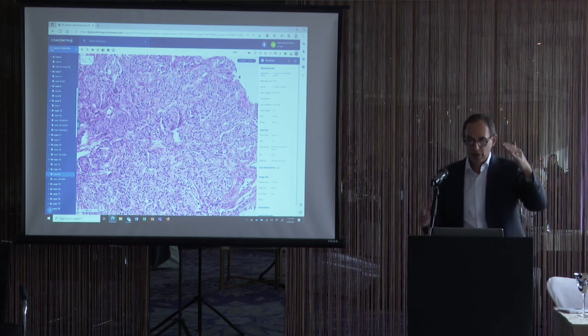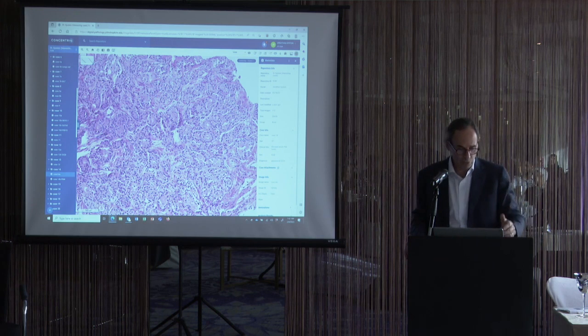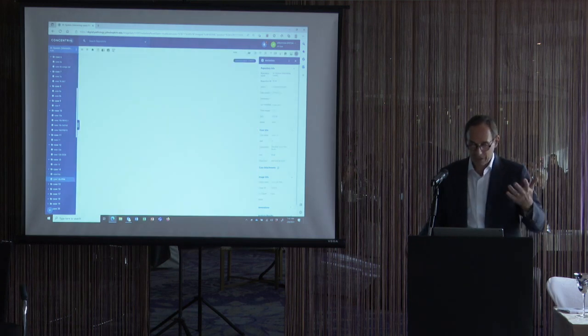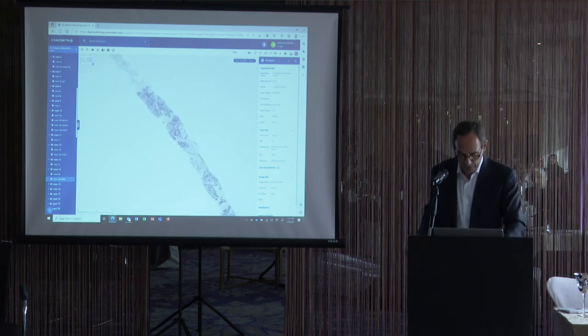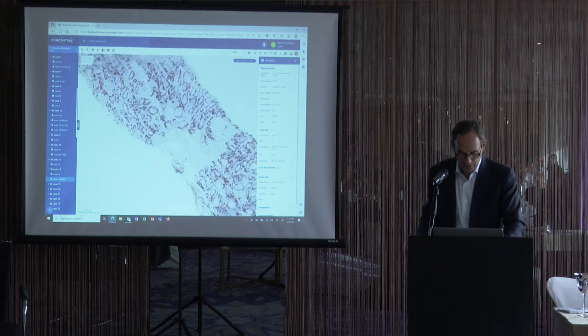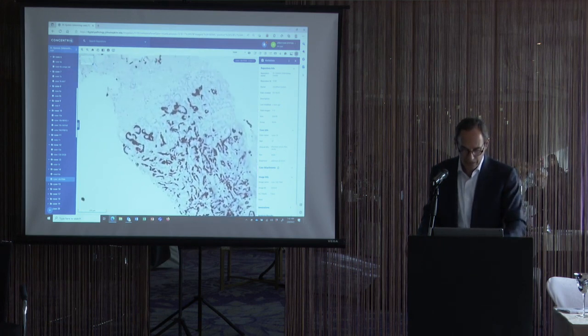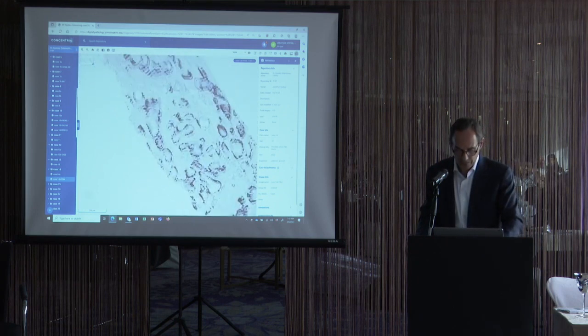You have to say, okay, these are all the features that Dr. Epstein talked about favor cancer. And there's just not many features favoring cancer in this biopsy, despite it architecturally looking so abnormal. In that case, you have to say, okay, let's step back, let's do a basal cell marker, and see if it stains like cancer or if it doesn't. And you can see even at low power, there's too much brown here. So all of these glands contain a basal cell layer. These are all adenosis, florid adenosis of the prostate, not cancer.